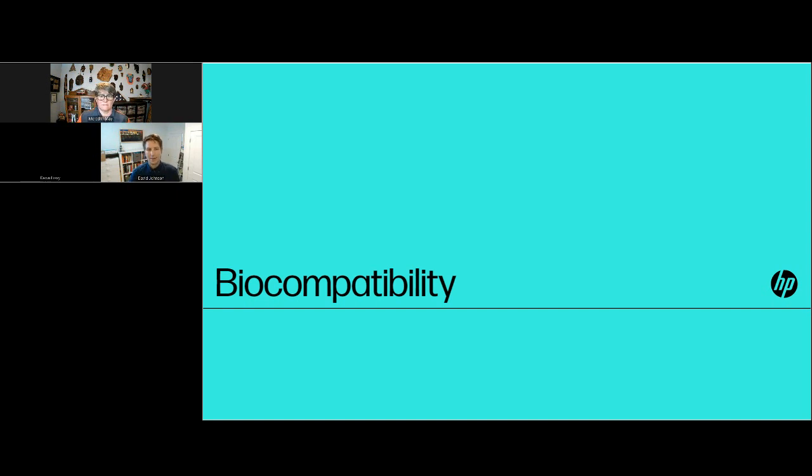Yeah, and then we talked about including biocompatibility early in the engineering design. You mentioned looking at that as a way to claim an easier path, but also that a lot of companies go through this process and biocompatibility comes last, which can cause a lot of issues. So how should teams and managers on product design include that aspect in their part design?